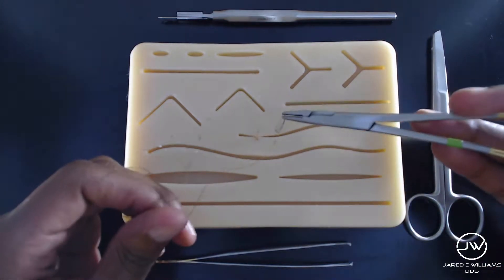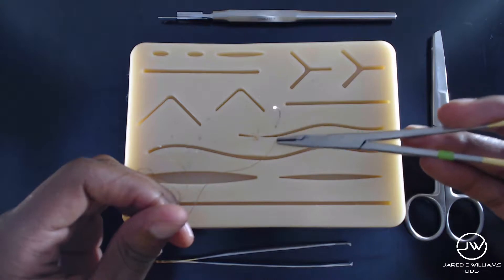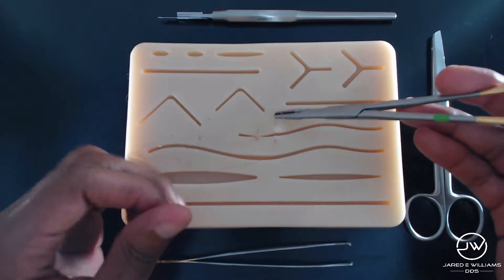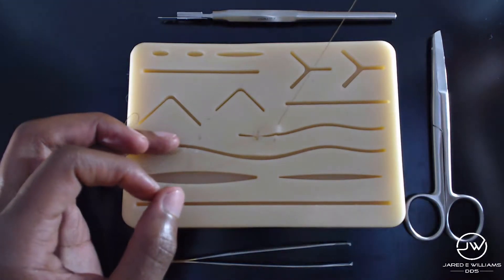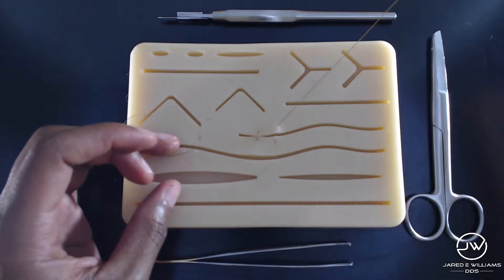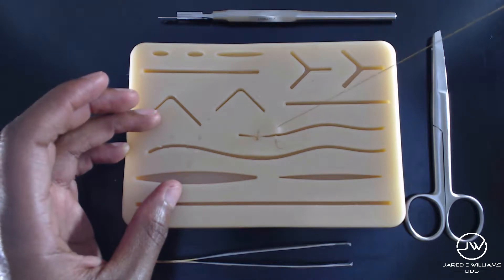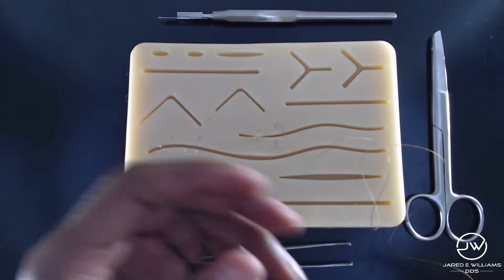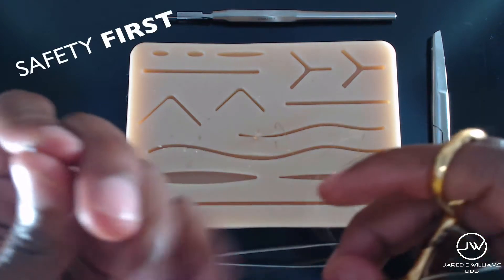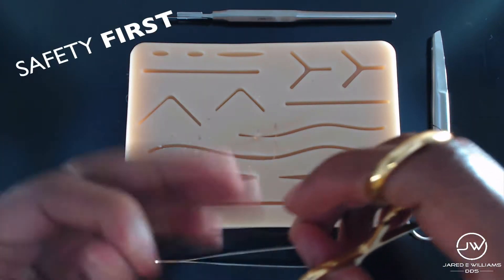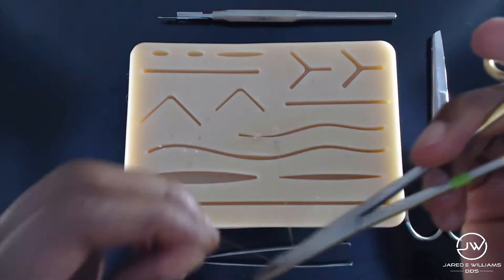If you can't get two, if you can't get the tissues at the same time, don't be alarmed. You don't get extra points. Like one of my mentors used to say, you don't get extra points by getting both tissues. I'm going to leave a tail present and I'm going to grab my suture so I make sure it doesn't stab me.